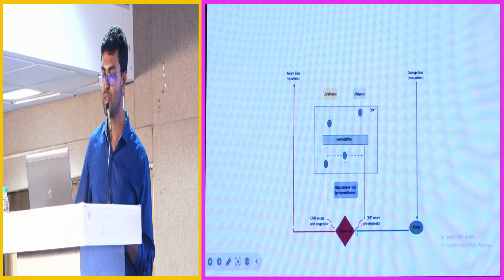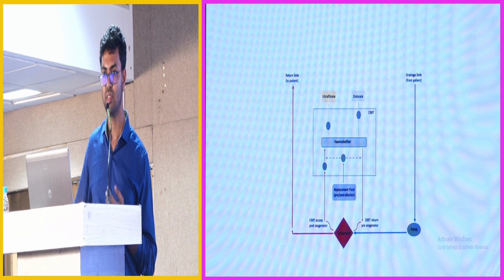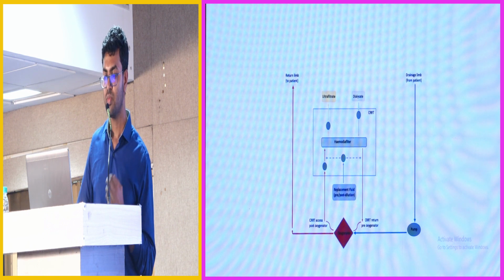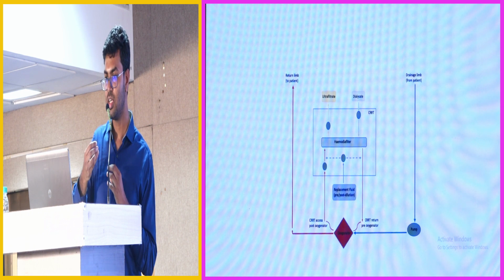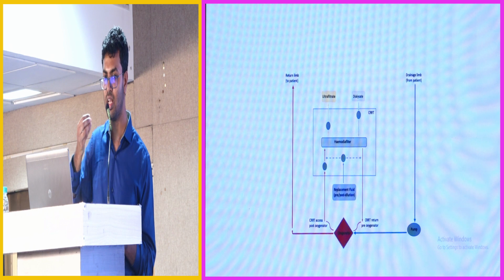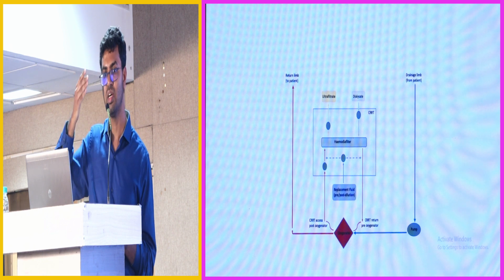And there will be a positive pressure buildup here. This positive pressure will be around plus 200 to plus 300 millimeters of mercury. So what we want, whenever you are connecting this renal replacement circuit, is that we don't want any clot or air bubble to go into the arterial system, so that it will embolize through the circuit and go to the brain and cause ischemia.